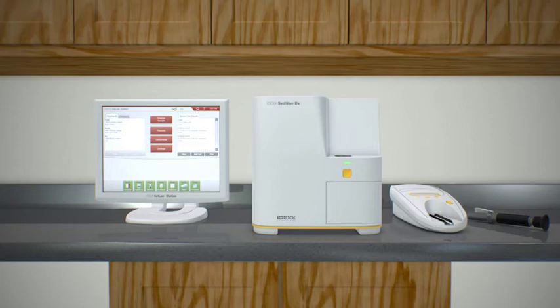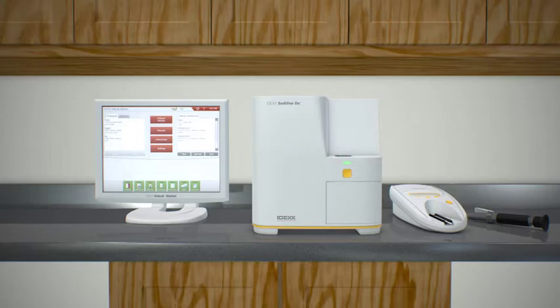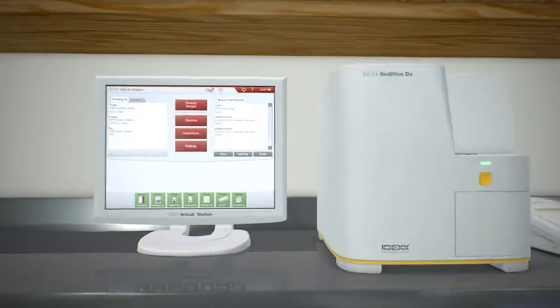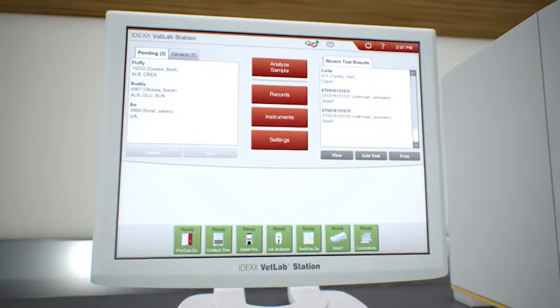With IDEXX two-way integration, we've initiated the run from your practice management software. All the patient information is transferred over and the charge is captured.